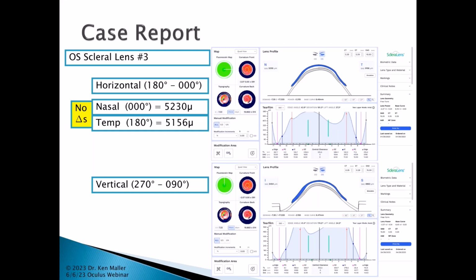And I worked very, very hard, and the scan did take quite some time before we were able to get good, reliable data on him. It would have been absolutely impossible without him being anesthetized. So, you know, it's not mandatory, but if you go to take a scan and you see that the patient's having any trouble, without any hesitation, I'll go ahead and put a drop of proparacaine in their eyes so that they're more comfortable to sit for the scan.